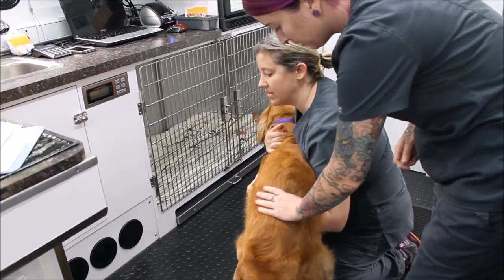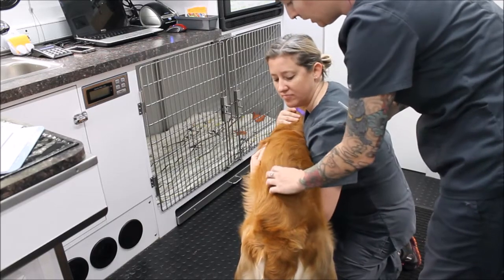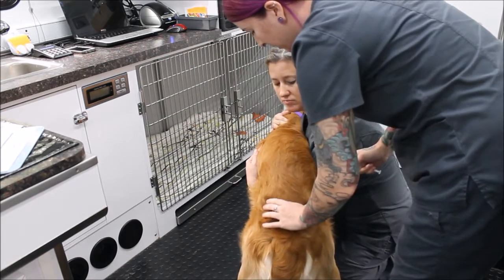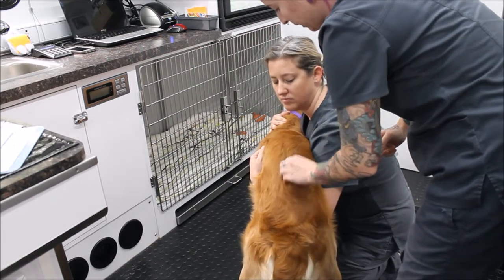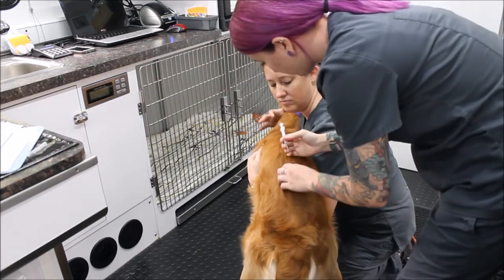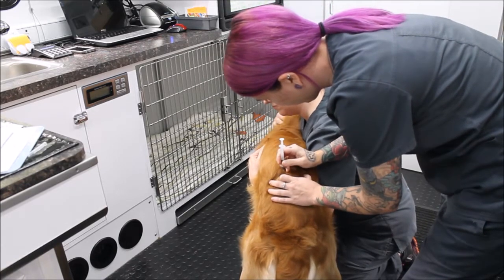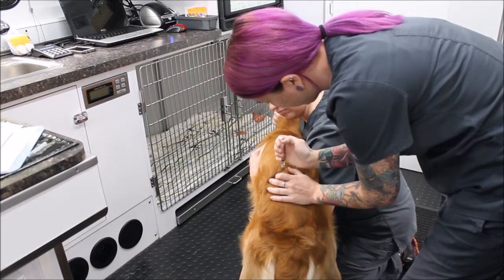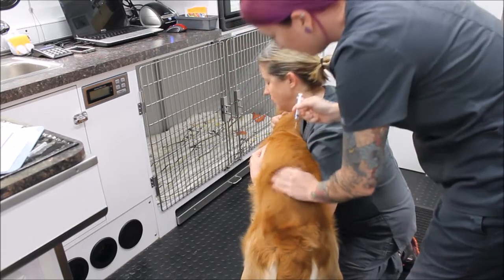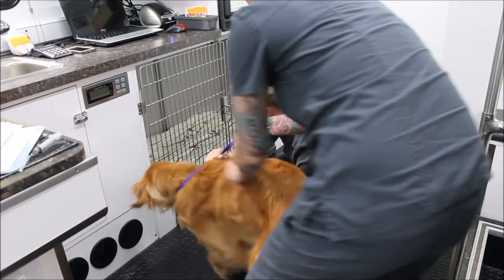Now I'm going to give my dog his pre-anesthetic butorphanol injection IM in his lumbar muscles. I feel for his 13th rib and his iliac crest, then feel the spinal processes. I've got my butorphanol and I'm going to go 2 to 3 centimeters straight down, pull back to make sure I don't aspirate blood, administer it, and give it some massage.